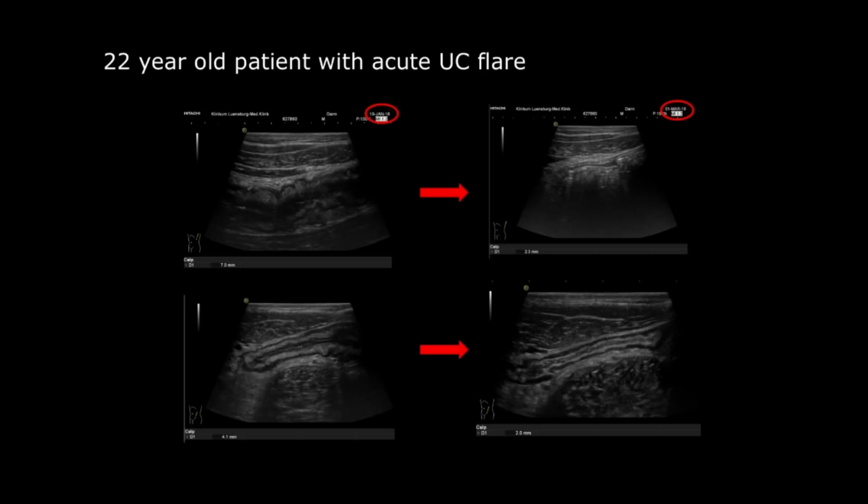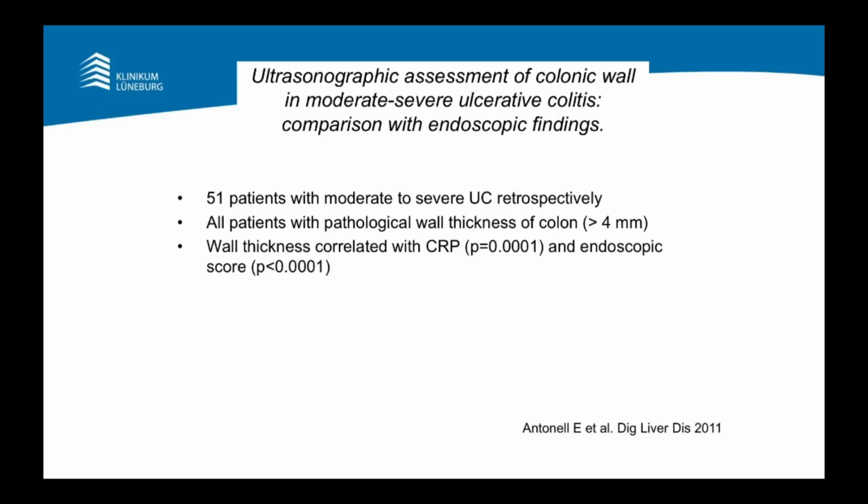So a clear response of bowel wall thickness in response to anti-inflammatory therapy. Very easy to detect and to follow up. Now what's more recent data?